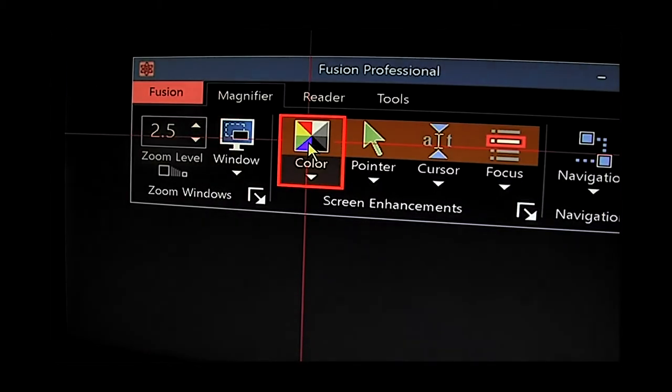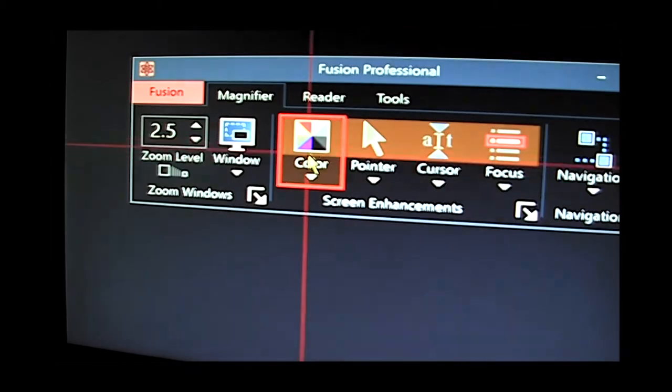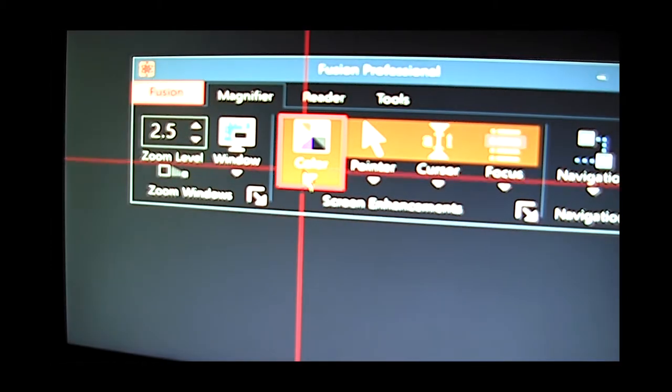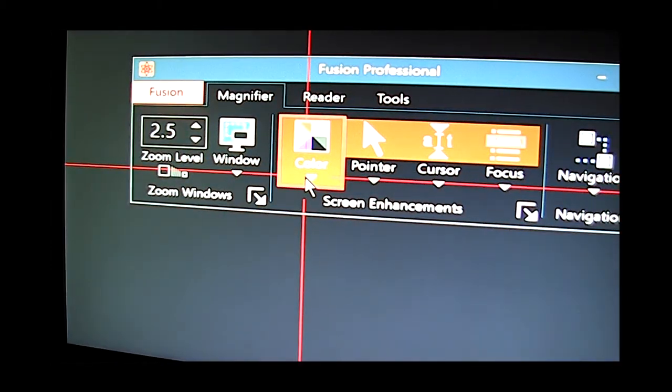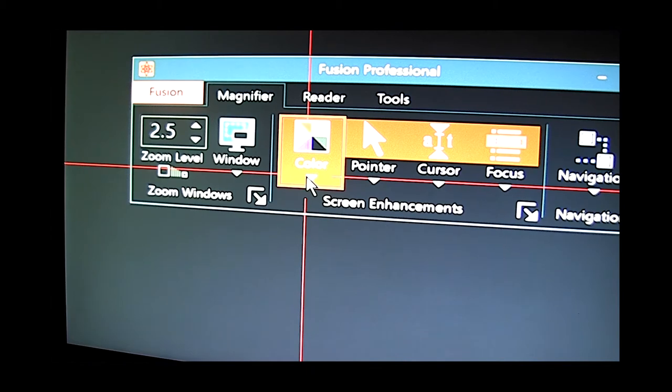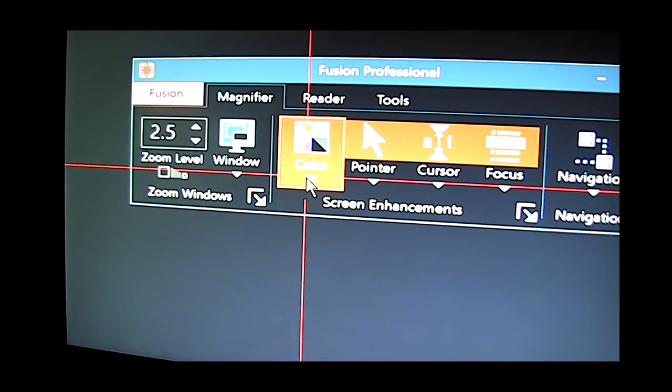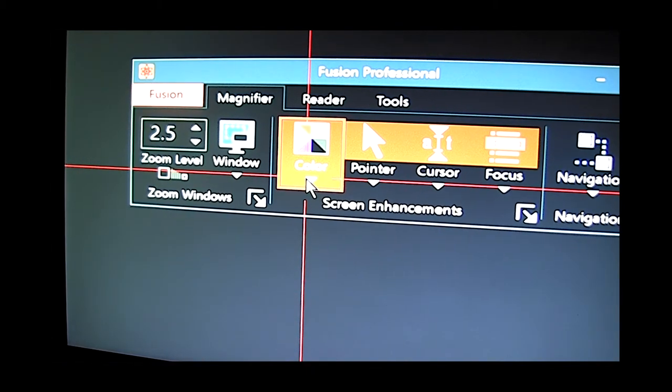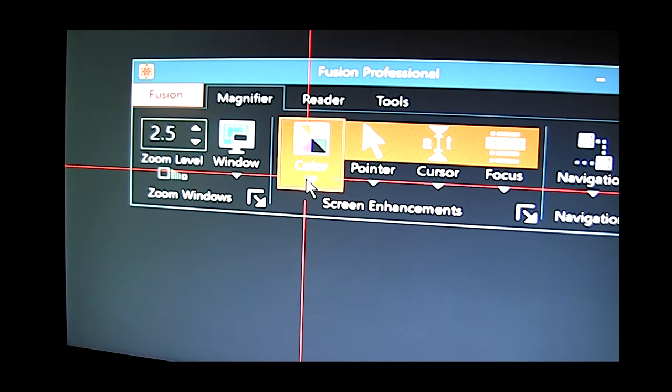So for example I can very easily reverse the background of the screen to be black or some other color and this is particularly useful for people who are glare sensitive which very commonly occurs for people with low vision conditions.